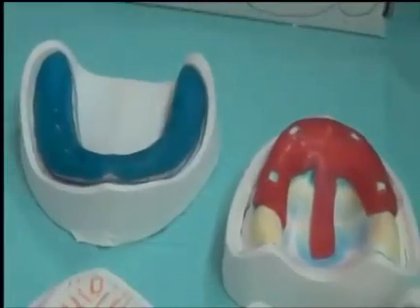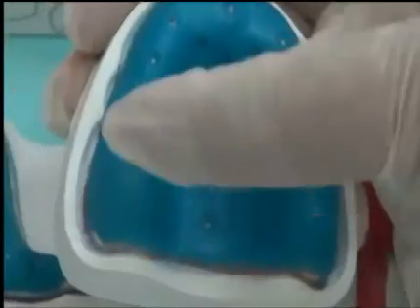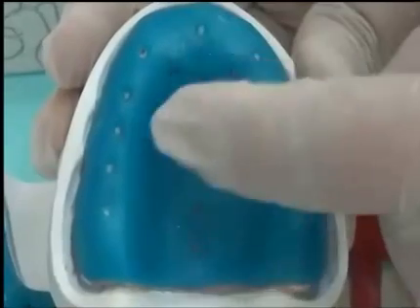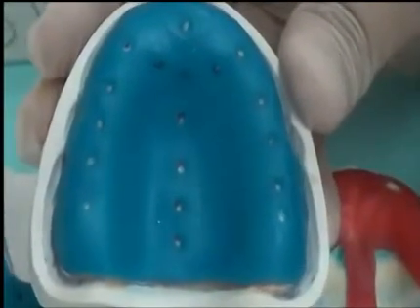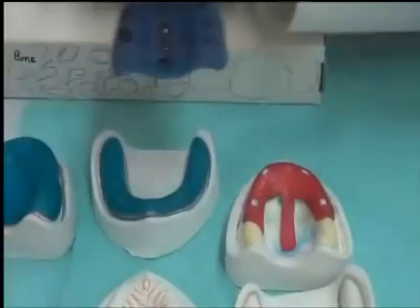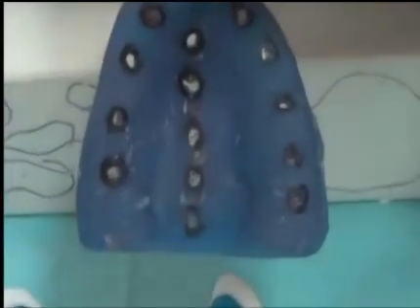From the upper, we place the holes in the following areas. Once more, on the areas we need to relieve, which are in front of the tuberosities, over the crest of the ridge, over the incisive papilla, the rugae area, and the mid-palatine suture area, just before placing the handle. Once we place the handle, we will have the following situation with holes inside, and impression material is free to escape from these relief areas.